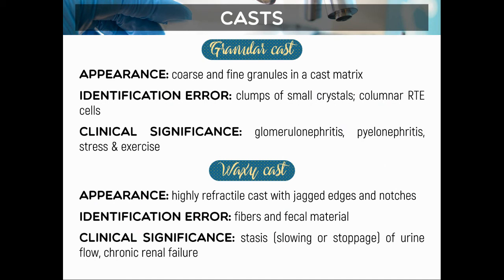This is a reminder to everyone that, by the book, it is not really necessary to differentiate between coarse and fine granular cast. But there are some institutions or laboratories that prefer to identify which type of granular cast it is, either coarse or fine, because they have the same clinical significance.